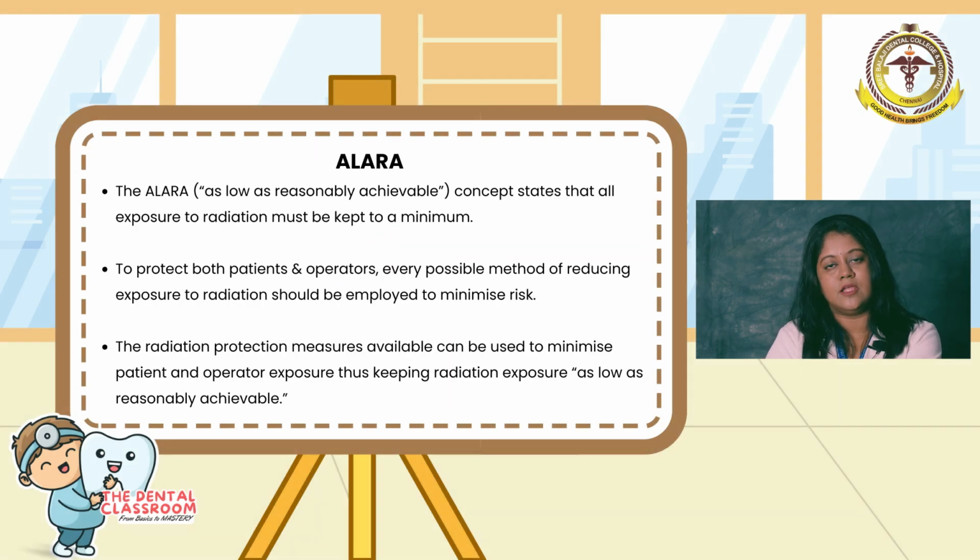Finally, I would like to say you have to follow the ALARA principle. What is the ALARA principle? It is nothing but as low as reasonably achievable. It is a concept that states that all exposure to radiation has to be kept to a minimum to protect both patients and the dental radiographer or the dentist. Every possible method of reducing exposure to radiation should be employed to minimize the risk. So, the radiation protection measures available can be used to minimize patient and operator exposure, thus keeping radiation exposure as low as reasonably achievable.